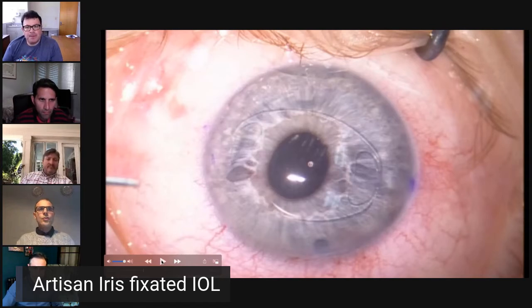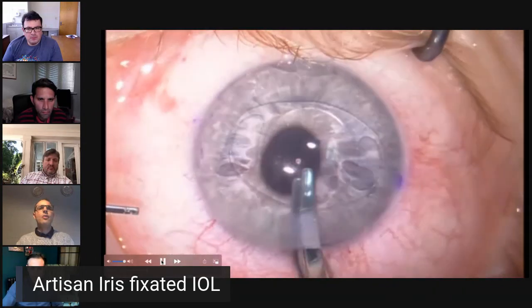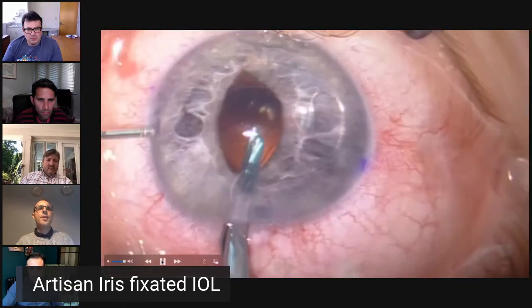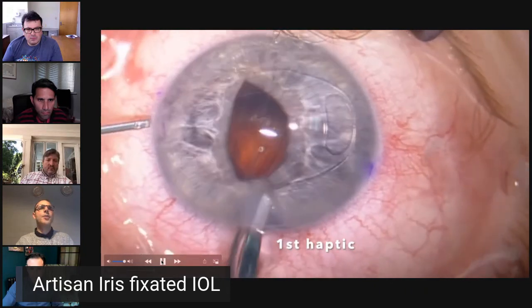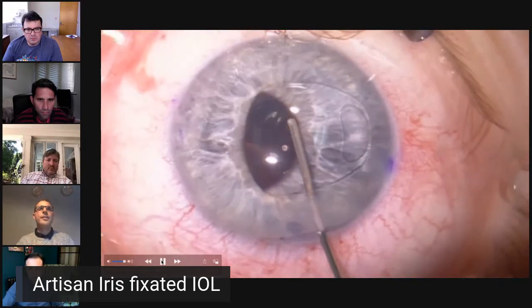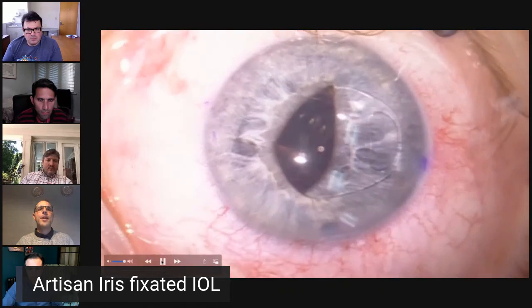Right. Good. So once the lens is in the correct meridian, I hold it from the center. I'm holding it now with my right hand, and I made two small paracenteses at 3 and 9. I put it behind, and with a lacrimal cannula, I just tuck it, make sure it's nicely tucked. So this is, I engage the first haptic. This is a really important tip: I like to sweep the iris a little bit. This is really useful when you try to engage the second haptic behind the iris.